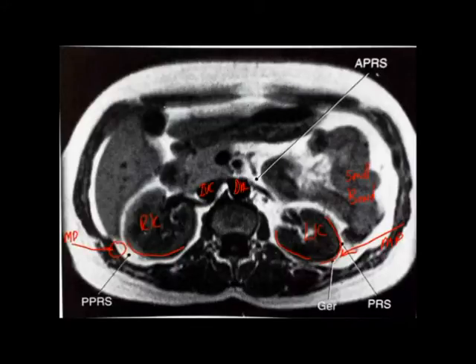which, as we have discussed previously, is the deepest point in the abdominal cavity when a person is lying supine. Notice that it all changes when a person is erect. But lying supine, this is the deepest portion of the abdominal cavity. We have renal spaces, posterior and anterior, but we're not really going to worry as much about those because on many images they're very difficult to see depending on a patient's body habitus.